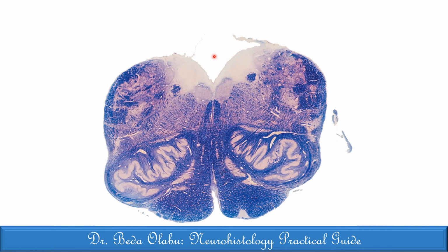Yes, so I wanted to differ with Dr. Kibaso in terms of whether it's open or closed. It looks like it's open medulla. You can see the presence of the fourth ventricle with the periaqueductal gray matter surrounding it. And then also the presence of the convoluted inferior olivary nucleus shows that it's upper medulla.